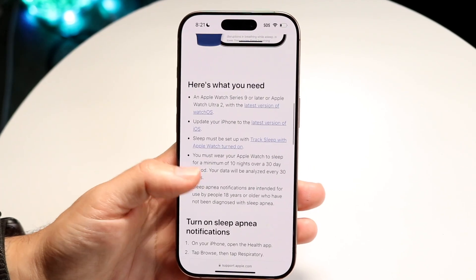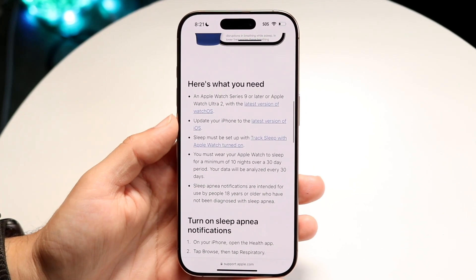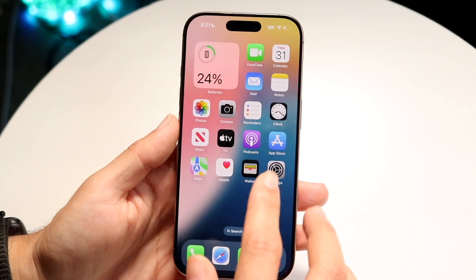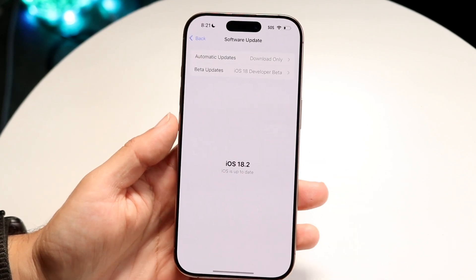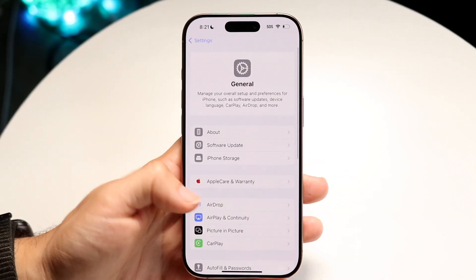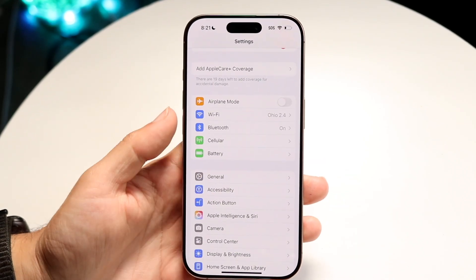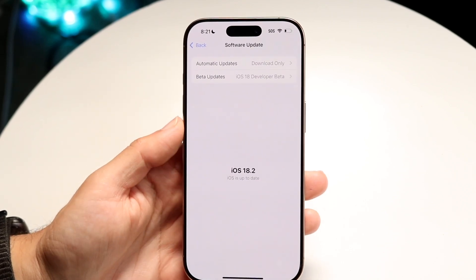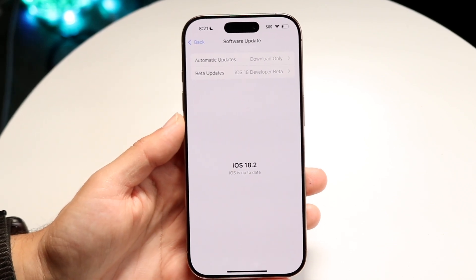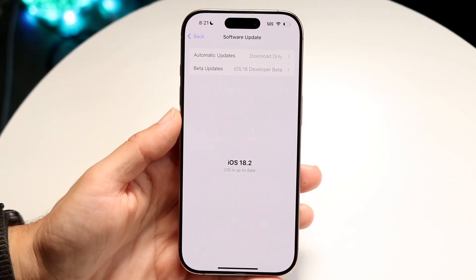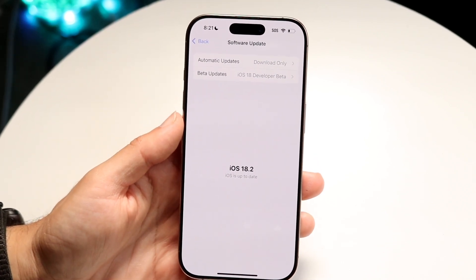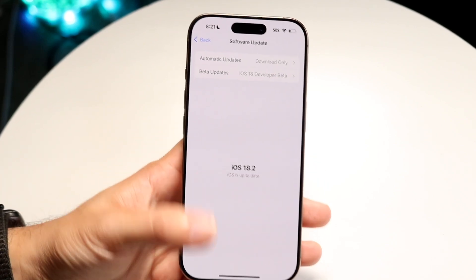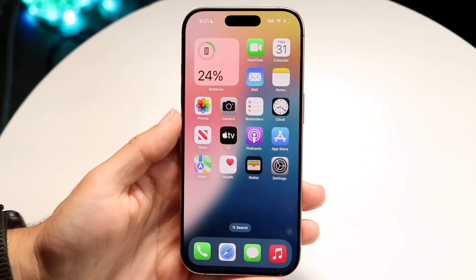You will also need to be on the latest version of iOS 18 — specifically iOS 18.1 or above. Go to your iPhone Settings, tap General, tap Software Update, and make sure you're on iOS 18.1 or above. You should also update your Apple Watch as well.